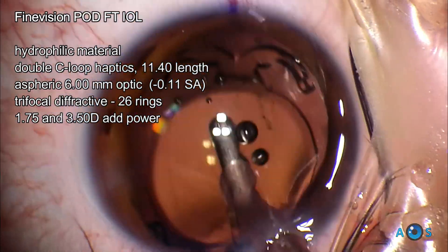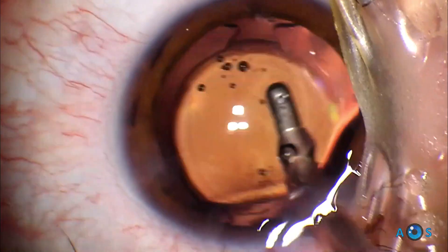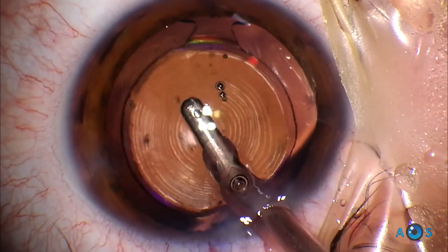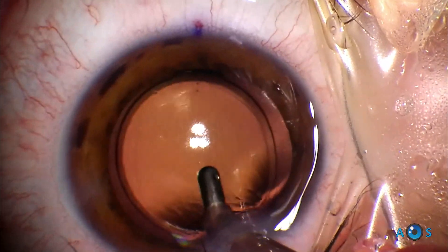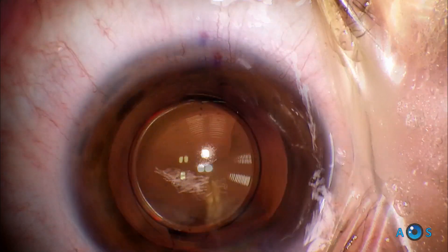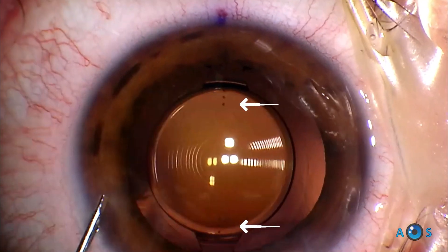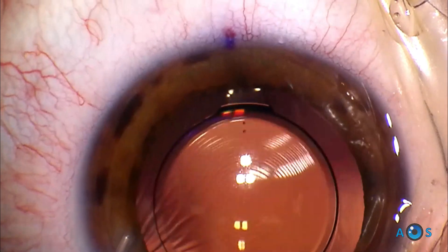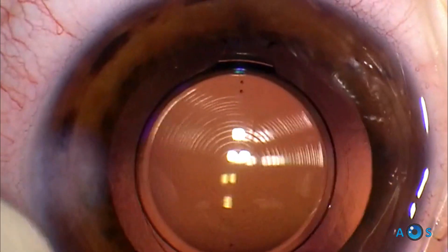This FineVision is the POD-FT model which provides toric correction. It is a very stable lens with a total of 4 haptics and a double C-loop configuration. It is very easy to rotate in either direction, so it is very surgeon-friendly in cases of toric corrections. Being a trifocal design, some loss of contrast sensitivity is to be expected. Both hyperopic and myopic patients tend to be very happy with this lens, assuming a correct explanation of the trade-off between spectacle-free vision and some contrast reduction.